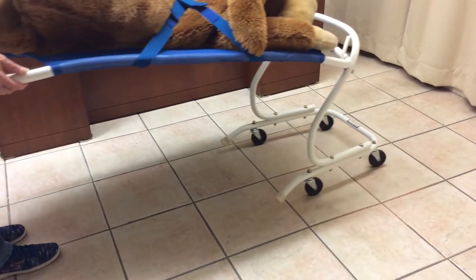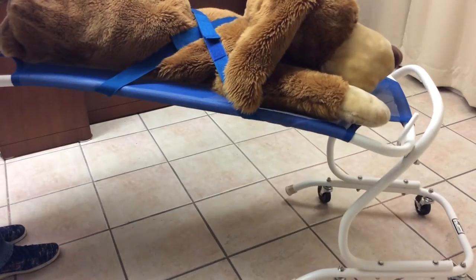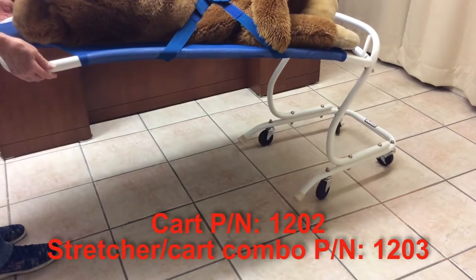You use it like you would a wheelbarrow. Move it forward, reverse, or sideways. It's that simple, and it may be stored under a desk or counter.